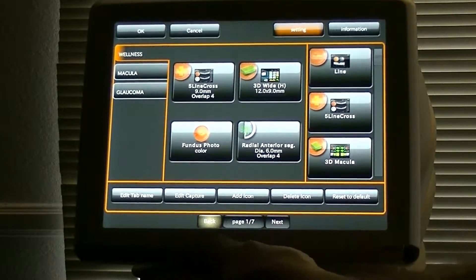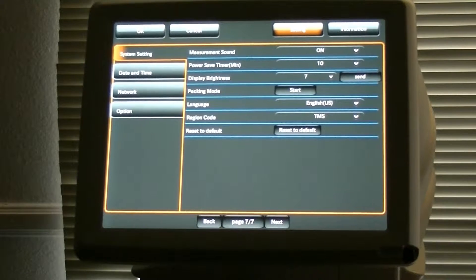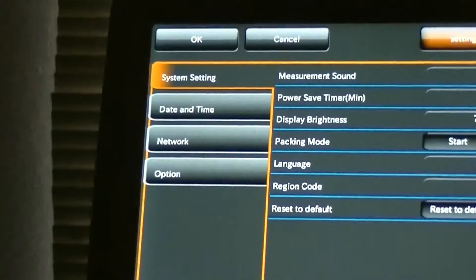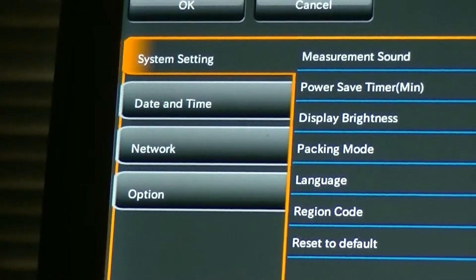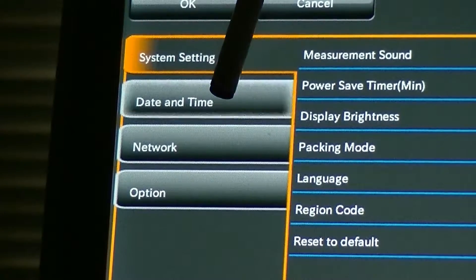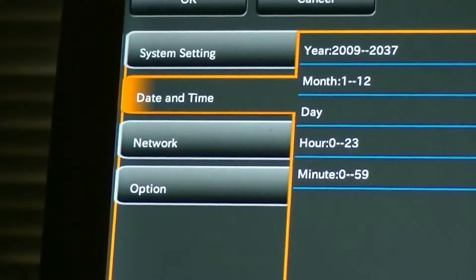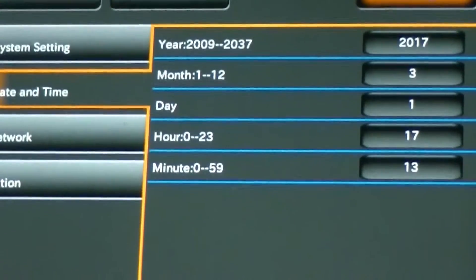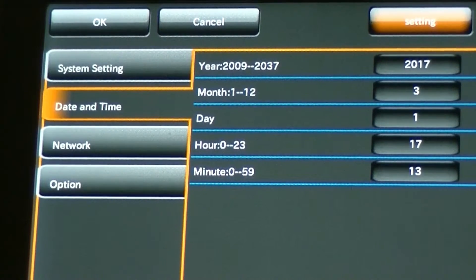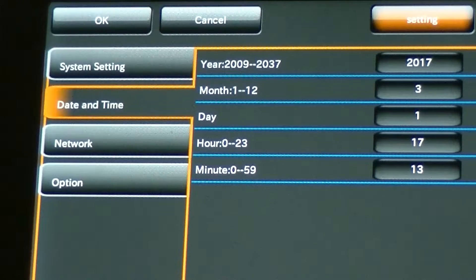Just go back because it's on page seven of seven. Once it's on page seven of seven, then you can see right here along the left-hand side you'll see Date and Time. So you're going to click that. Once you click that, you'll see it changes to the year, the month, the day, the hours, and the minutes. And that's where you're going to change your time.